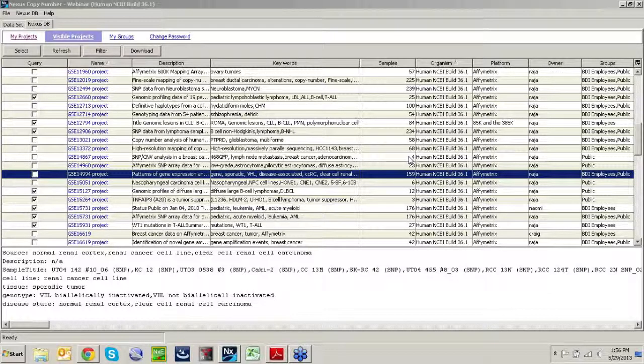Thank you. Can you explain how there is a loss but no imbalance in the B allele frequency? Sure. So this is something that we observe sometimes in cancer samples when we have more than one clone present within the tumor or the cancer cell population. What sometimes can happen is that in approximately half of the cells, we're going to have loss of one copy of the chromosome versus in the other set of the cells, we have loss of the other copy of the chromosome. When we look at the cell set overall, we're going to be able to see that all as a single copy loss, but because some of them have copy 1 and some have copy 2 present, it's still going to present as a balanced heterozygous state.